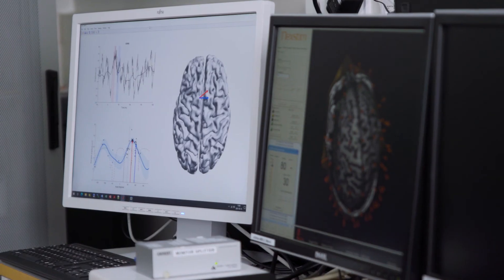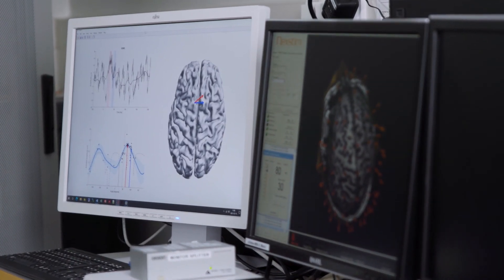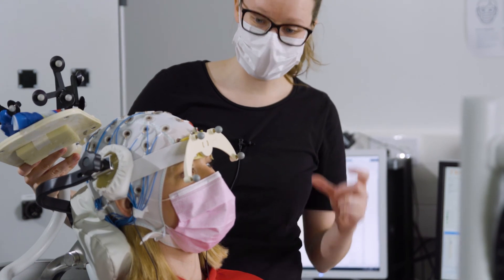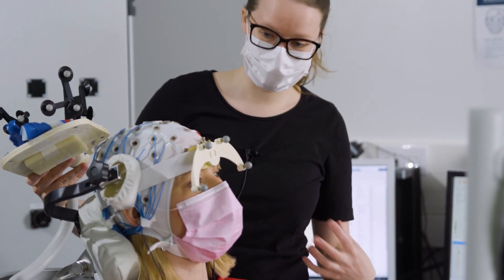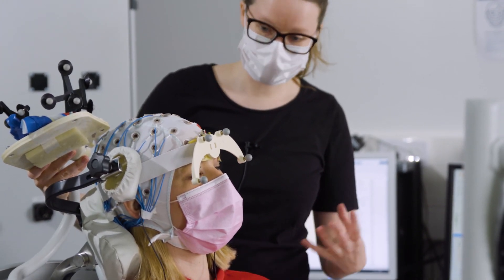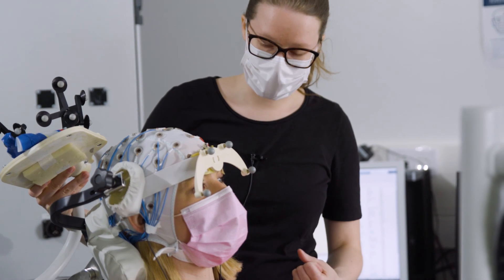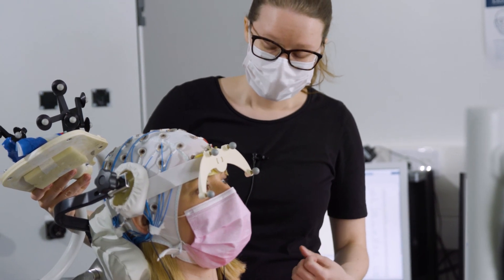When we get the biggest brain reaction right after the pulse, that tells us that it now best stimulates your brain.